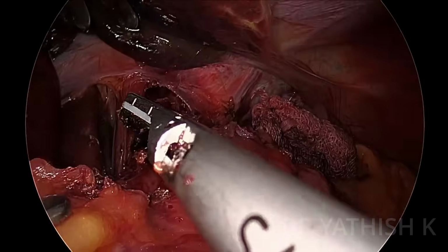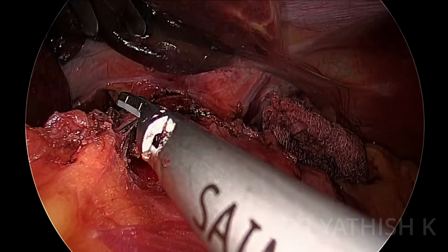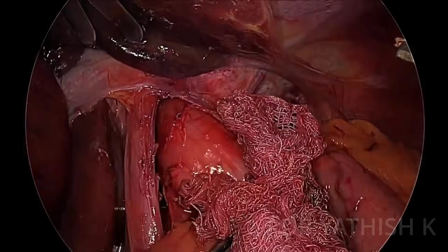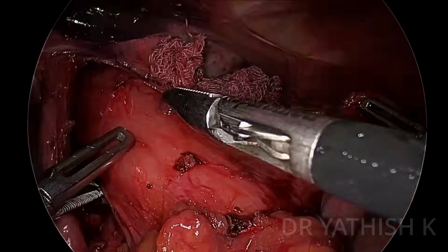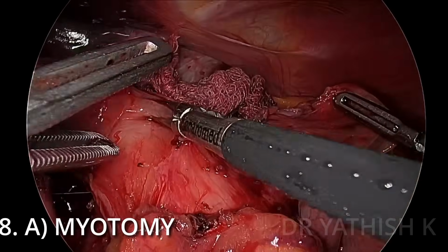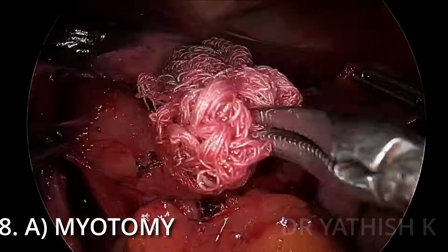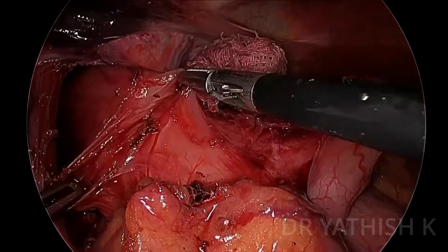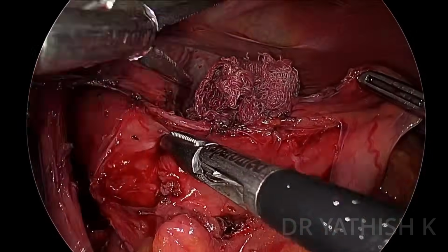Again, this step is rate limiting because your myotomy should always include the cardiac part of the stomach. That is why we call it a Heller's cardiomyotomy instead of just a plain Heller's myotomy. Once that is done, next we're going to jump into our myotomy proper. So how do we choose the site of myotomy? I usually start from the lower end of the esophagus and advance proximally.